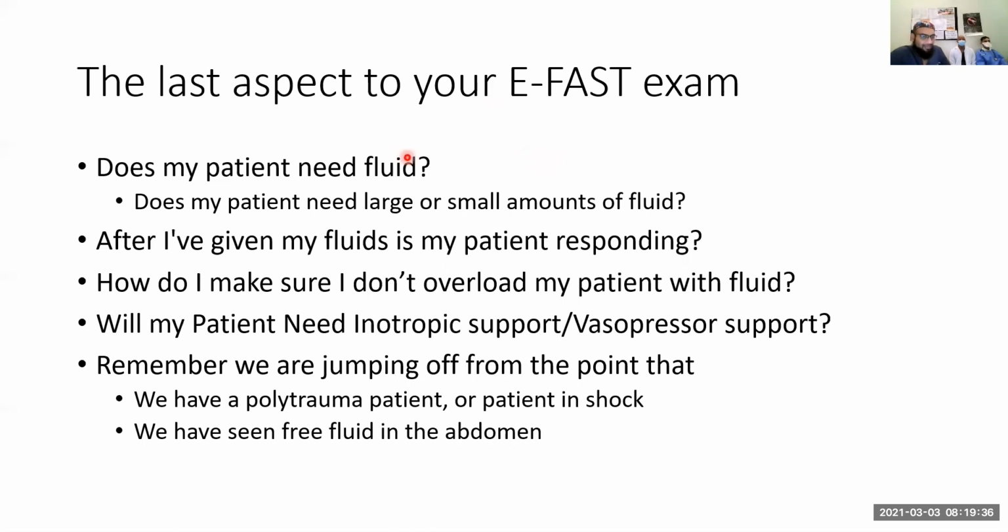Okay, so this is what we are looking at. Does my patient need fluid? Does my patient need large or small amounts of fluid? That's the other thing it helps us to decide. After I've given my fluids, is my patient responding? In other words, to monitor the response to those fluids. We have to make sure we don't overload our patient with fluid. And then does my patient need inotropic support, vasopressor support, things like that?